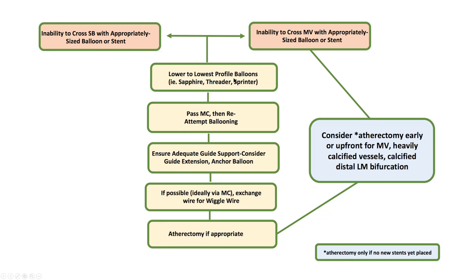The first step is to try smaller balloons, like the Sapphire Pro used in this case. Another option is to pass a microcatheter like a Corsair or a Turnpike. Another is to increase support, for example with anchoring techniques or with a guide extension. Bifurcations are well suited for anchoring because we already have a wire in both branches — we can use an anchor balloon in the main vessel to advance equipment into the side branch, and we will stent the main vessel anyway. Another option is to use a wiggle wire, which may help with navigating through the stent struts. In our case, atherectomy is not possible because we have already placed stents.